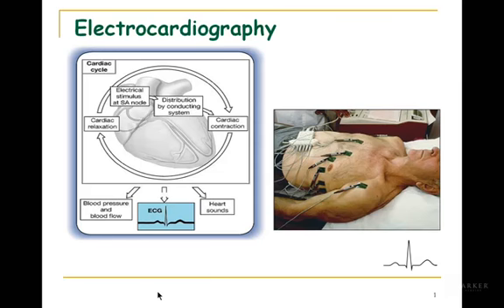This webinar is going to discuss the normal EKG, otherwise known as the normal ECG. EKG and ECG are synonymous. ECG is the English acronym for electrocardiography. EKG is the Dutch acronym. Often they use the term EKG because the first person to record the ECG on a human was a Dutch physiologist. So out of deference to his contribution to the field, often people use the term EKG.